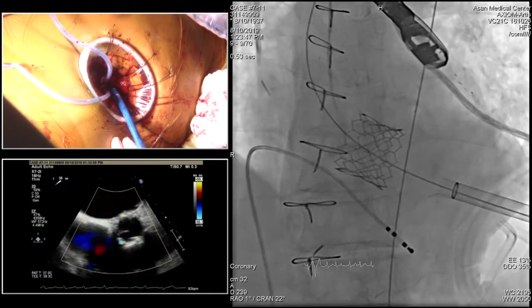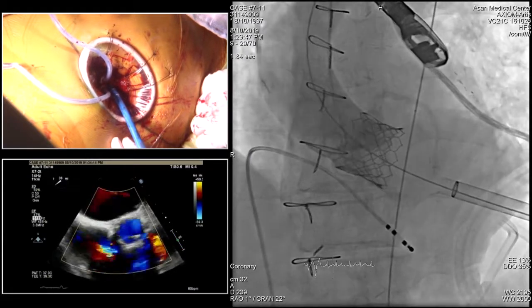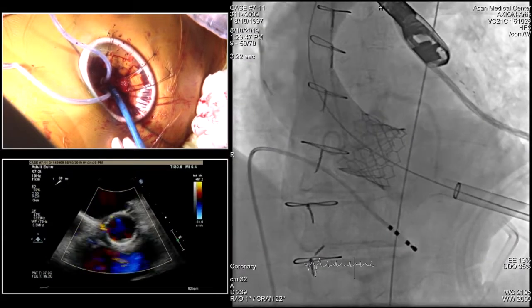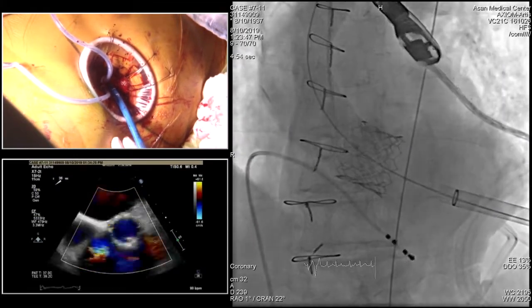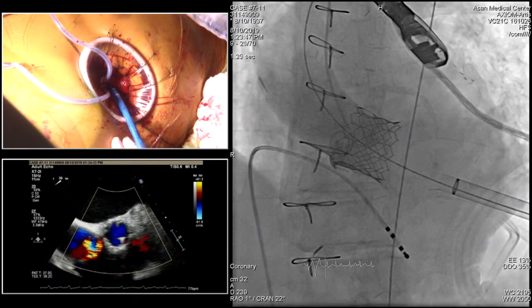I'd like to recommend less aggressively. Yeah. So we're gonna do just 1 cc overfill. When you look at the angiogram in the lower side, beyond Sapien 3, and now try to the less aggressive. So far, it is not 100% satisfactory, but I think it's acceptable, reasonable.